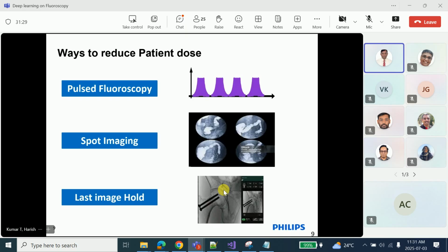1/30th of a second it gives you an image, a millisecond, right? So it is capable of giving you 30 images per second at that setting. If I go to 2 frames per second at one shot, that is one fluoro, it will give me 2 frames per second. So 2 seconds will give you 4 frames, 3 seconds will give you 6 frames. It's like that. If you set it to 4, it will be double. So the setting is available, and depending on the procedure you're doing, you can either take that setting by default or you can manipulate that setting manually. That's how you do it.